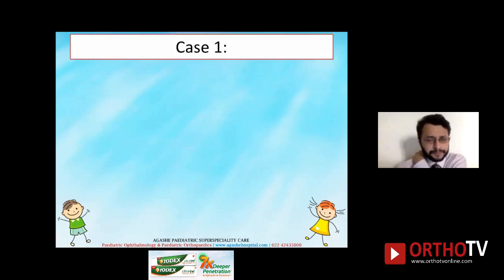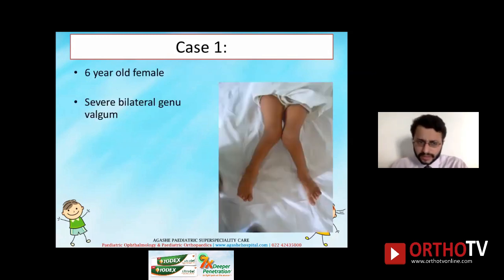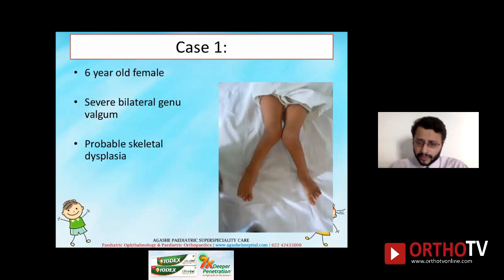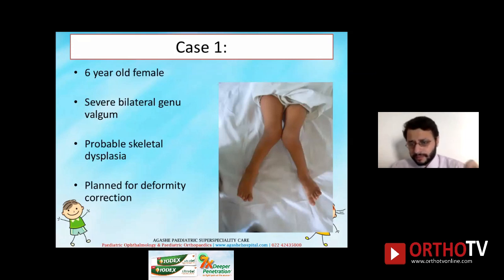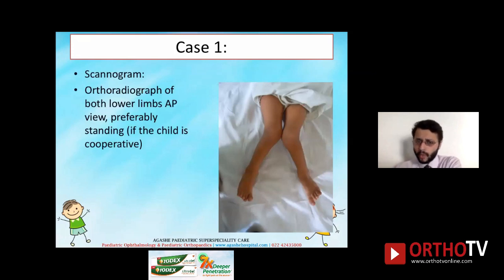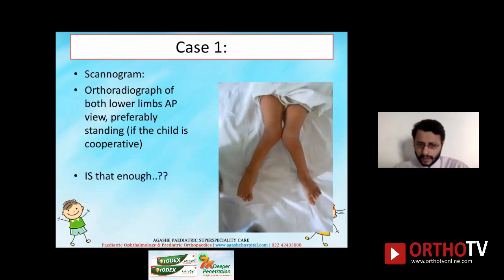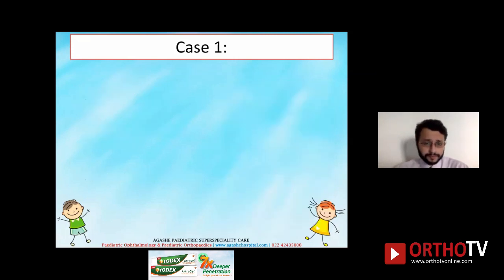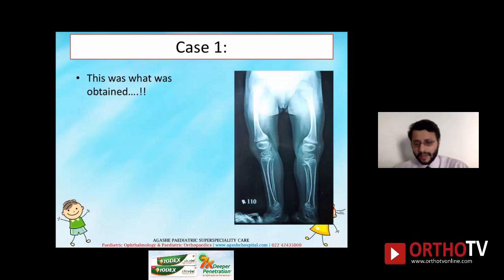The first case: a six-year-old female with severe bilateral genu valgum, obvious gross deformity of the knees, probable skeletal dysplasia. I planned for deformity correction. For any deformity correction around the knee, I require a scanogram — an orthoradiograph of both lower limbs, preferably standing. I sent for a scanogram, but the gross deformity seen clinically was not manifested in the X-ray obtained.